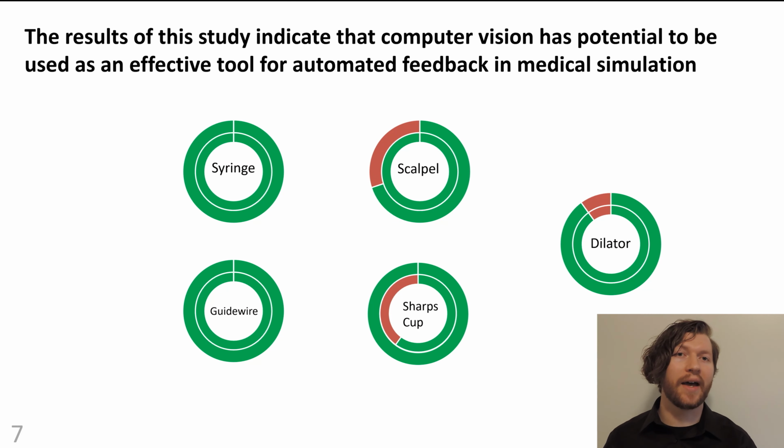Though the algorithm had some errors, it still shows the viability of computer vision as an asset in automated tool detection. The algorithm developed for this experiment is extremely simple, and with the use of more advanced methods, such as machine learning, the algorithm could become more accurate.